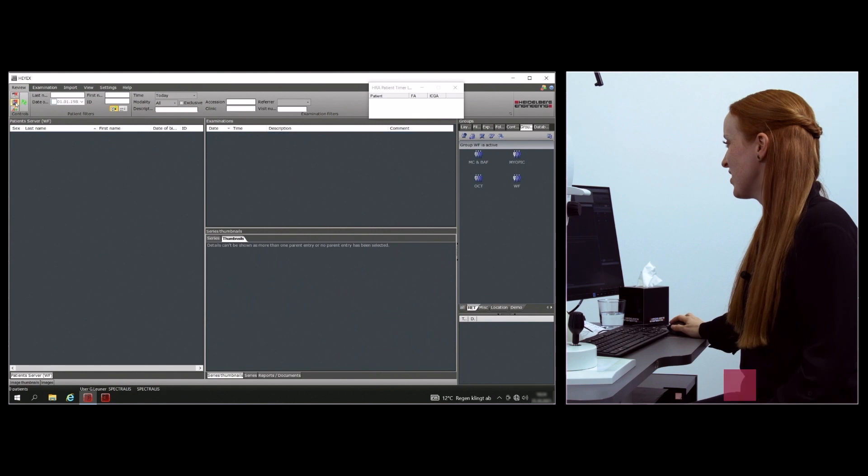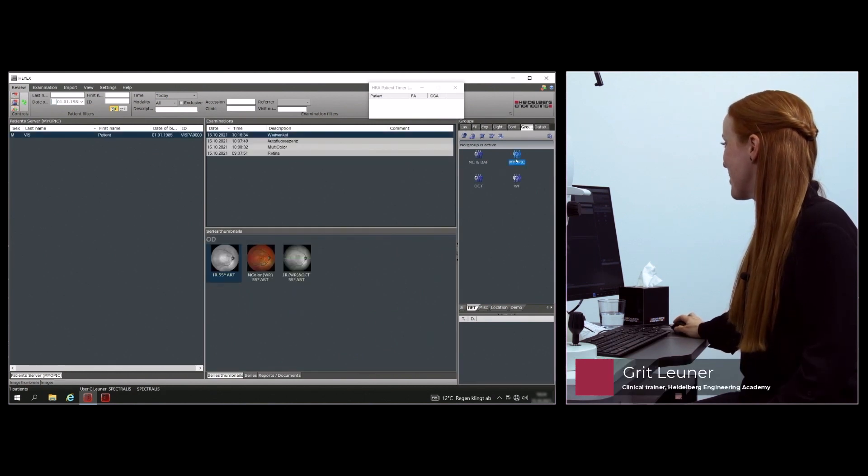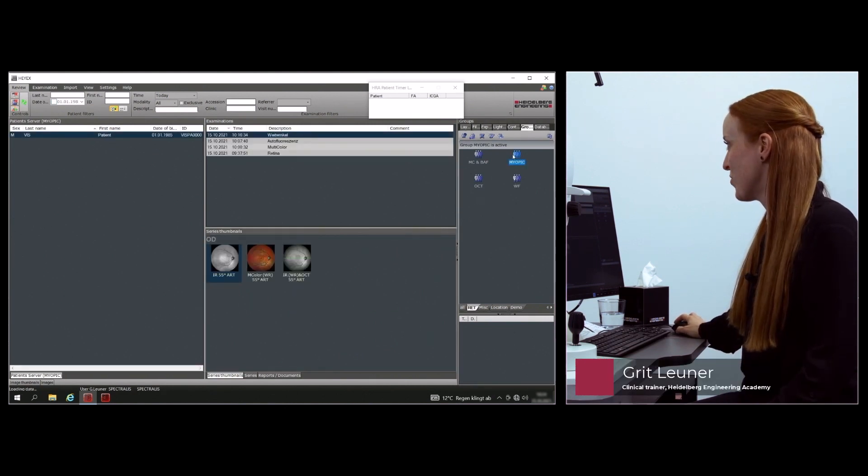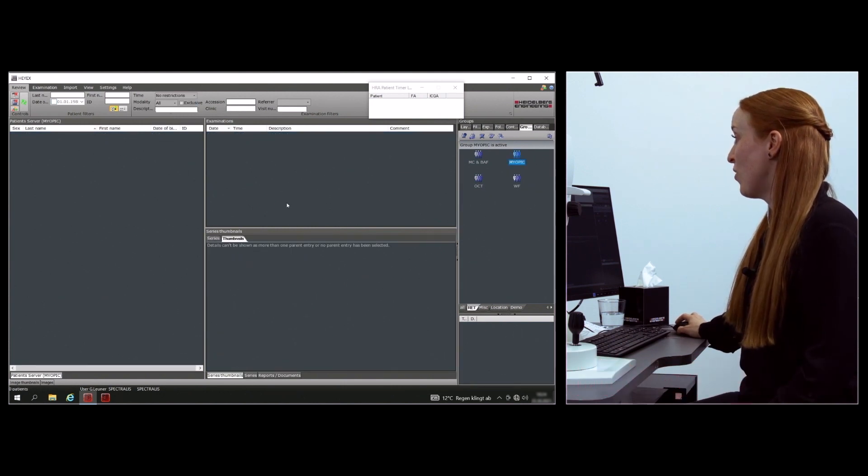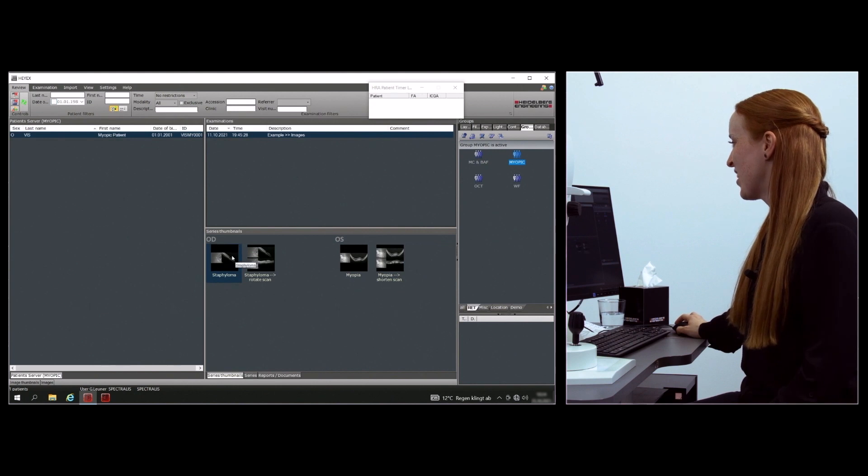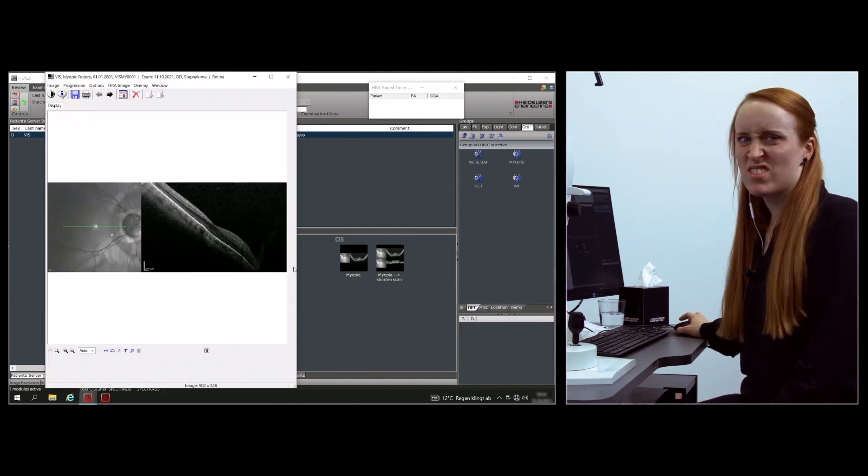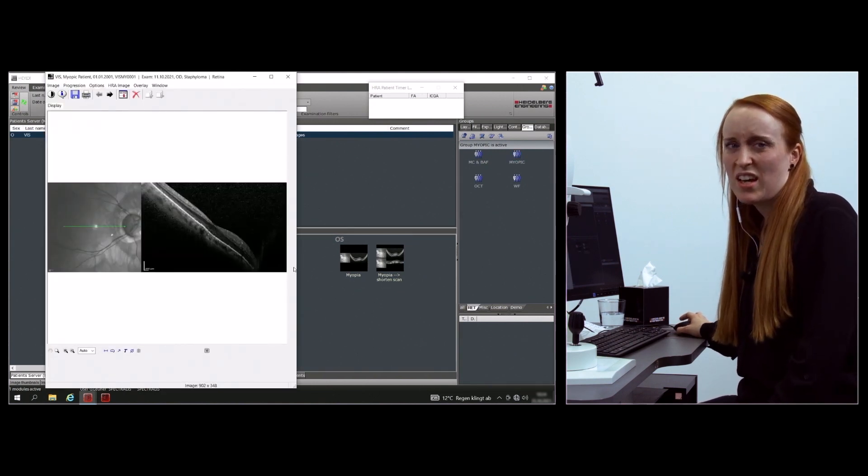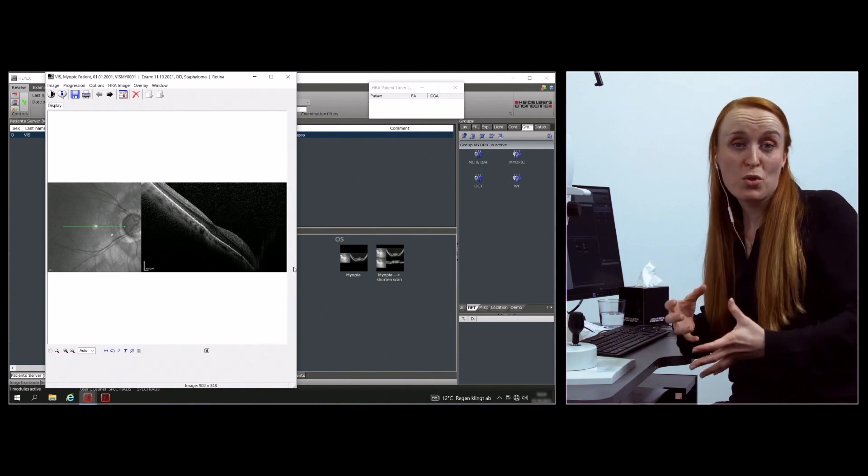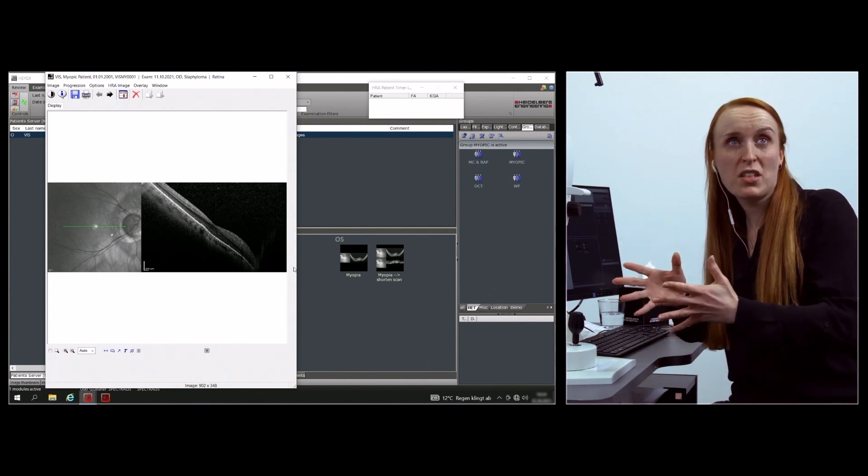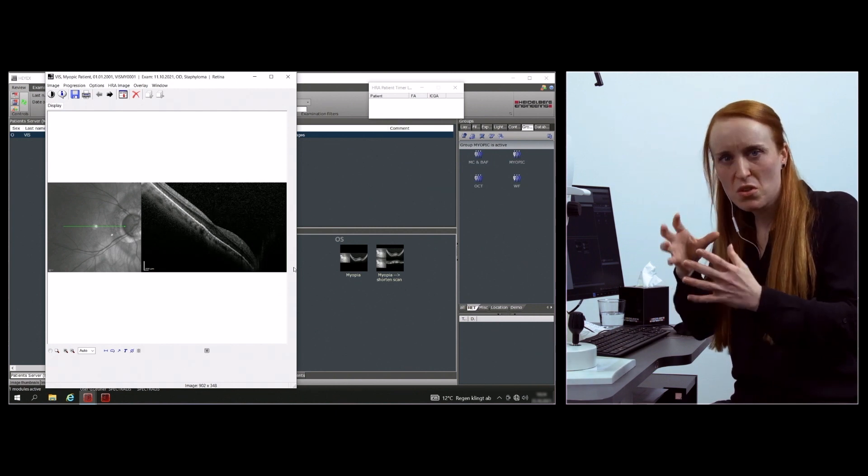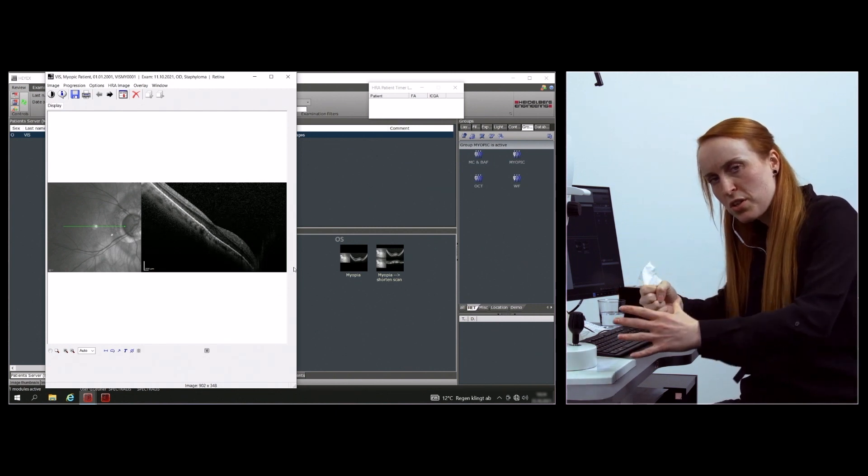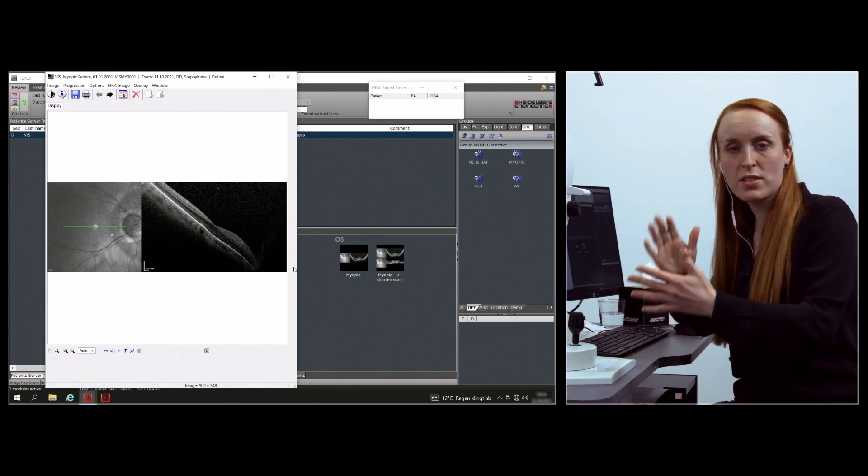I'd like to give you some tips and tricks for myopic patients. You probably know that we might have Staphyloma. Usually you'll take your camera and see that on the right corner this image is not that good, so you'll take your camera to the right side.